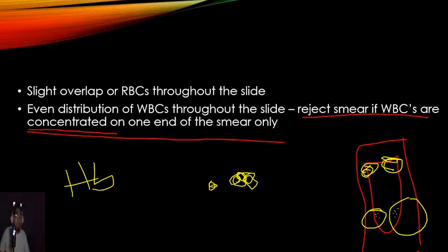Okay? Kasi paano ko ba explain sa inyo? When you make a smear, minsan nabibitin siya, hindi siya nag-aabot dun sa edge. Paano ba? Wait, tingnan ko muna yung itsura ko sa camera, baka hindi niyo nakikita. Nakita niyo ako sa camera, no? So, for example, ito si slide, kunyari malaki siya, ganyan. Alright? So, sometimes kapag nag-smear ka, gaganyan mo yung smear mo, 'di ba? Ayan yung spreader slide mo. May makikita mo yung blood, 'di ba? Parang gaganon siya. Mag-spread siya automatically by capillary action, right? And sometimes hindi siya aabot dun sa dulo.